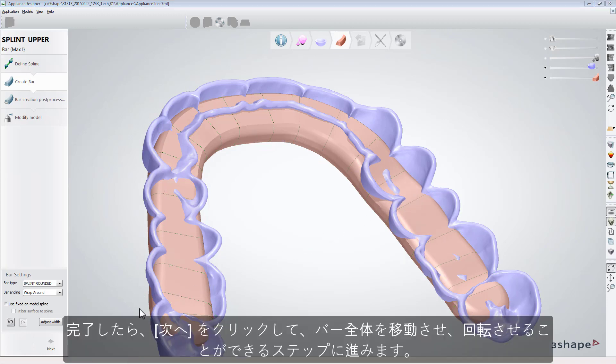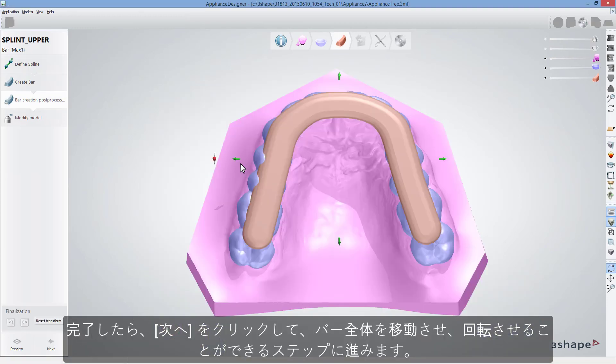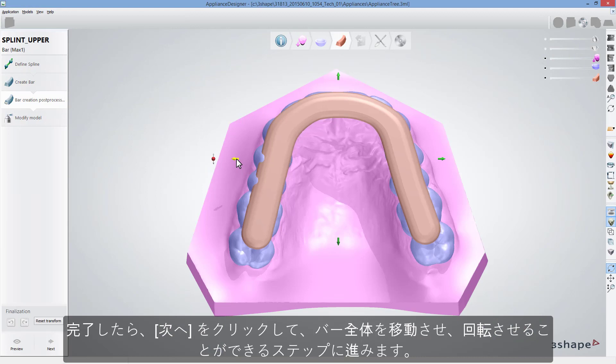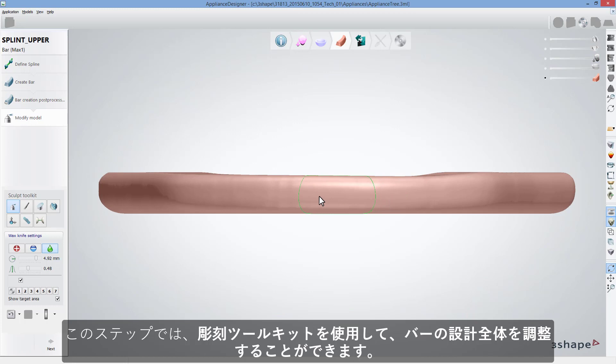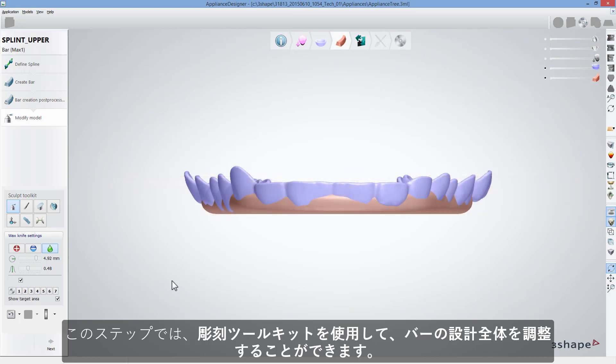When done, click Next to go to the step where you can shift the whole bar design or rotate it. At this step, you can make some adjustments to the bar design using Sculpt Toolkit.